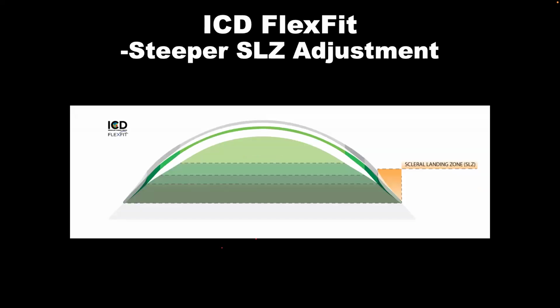And the reason why it is going to be a minus: if we flatten, we're going to let the lens sink in. If we're going to steepen, it's going to raise up. So that is why there are negative or plus signs in this landing zone.